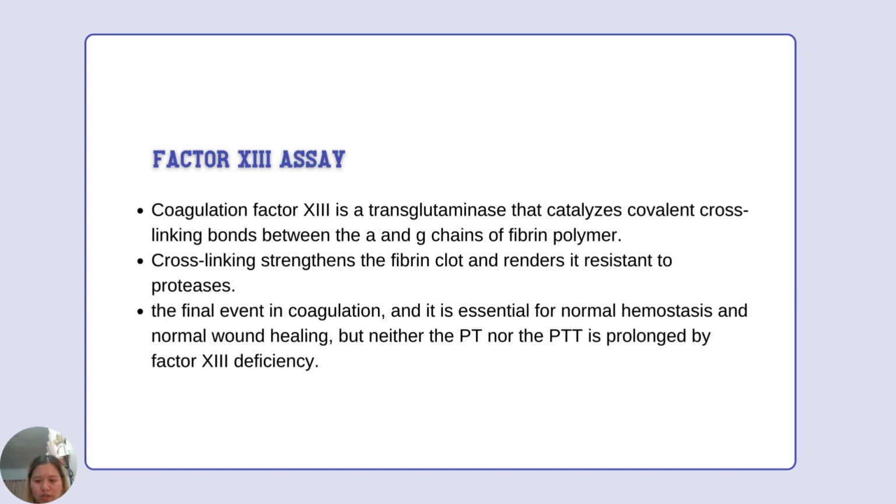So for the last one, the factor 13 assay, coagulation factor 13 is a transglutaminase that catalyzes covalent cross-linking bonds between the alpha and gamma chains of fibrin polymer. Cross-linking strengthens the fibrin clot and renders it resistant to proteases. It is the final event in coagulation, and it is essential for normal hemostasis and normal wound healing. But neither the PT nor the PTT is prolonged by factor 13 deficiency.